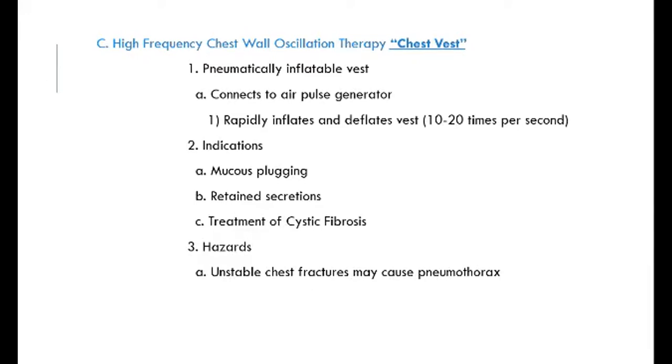Can't talk, right? You're trying to, it's shaking the whole body, and that's shaking all of the stuff off all of the segments. All right. What is happening is it rapidly inflates and deflates the vest 10 to 20 times per second. All right. This is another thing we use for cystic babies because it's so much.